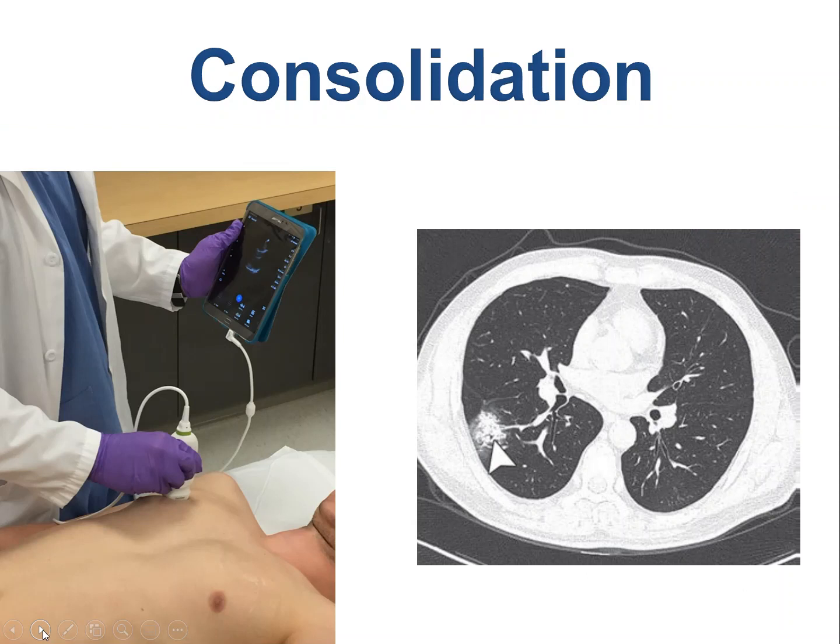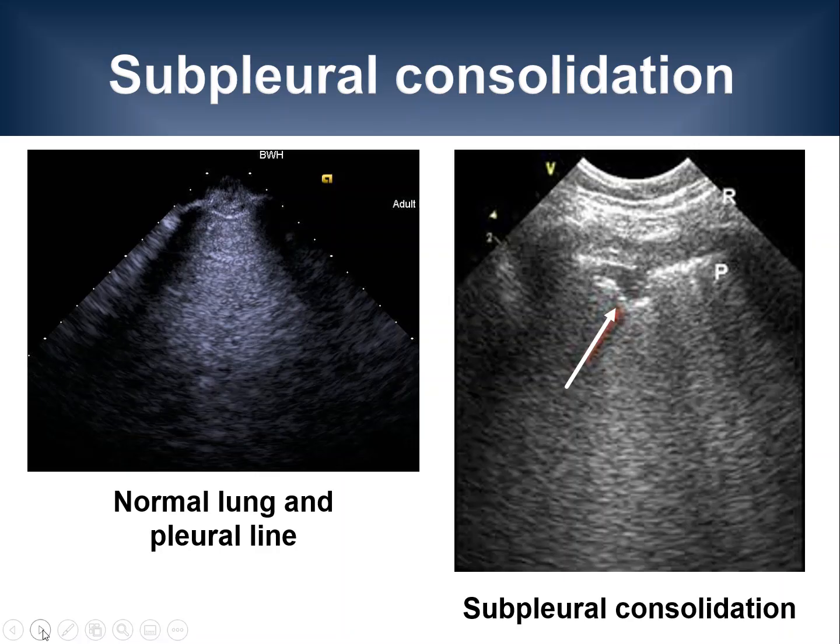Let's move on to additional lung ultrasound findings: consolidations. The first type of consolidation I would like to discuss is called subpleural consolidation. For comparison, I'm showing a normal lung image with a smooth pleural line on the left side of the screen. By contrast, on the image on the right, there is a hypoechoic or black area that looks like someone took a bite out of the pleural line. This is an example of a subpleural consolidation. You may also see adjacent B-lines.